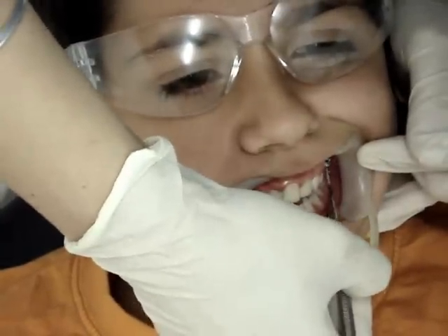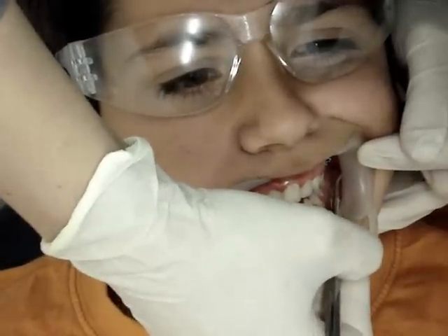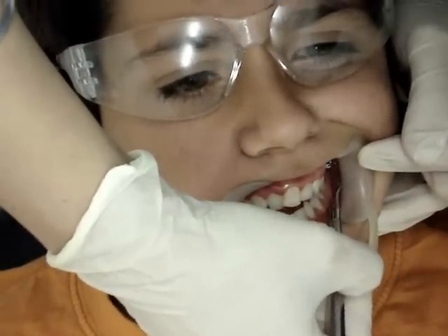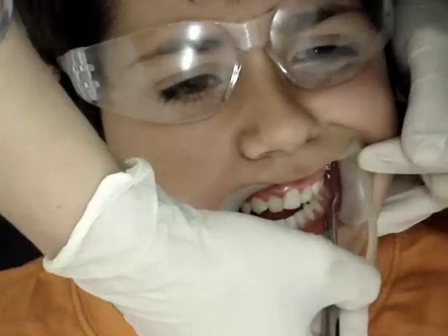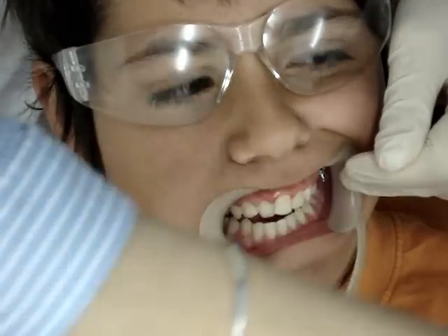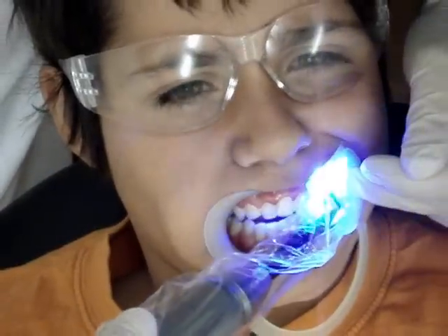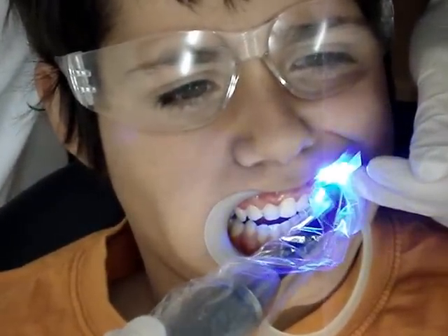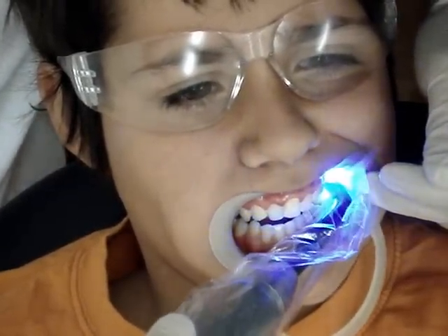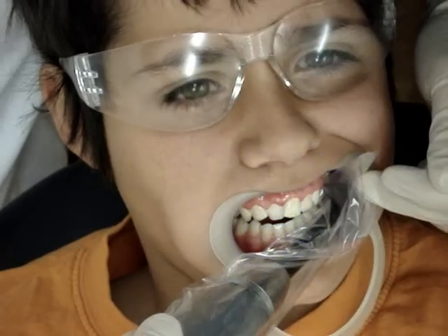What an exciting day. The brace will work really well. It will turn your teeth around. It will straighten your teeth. You will be amazed.